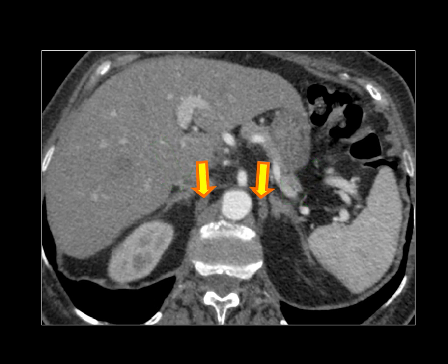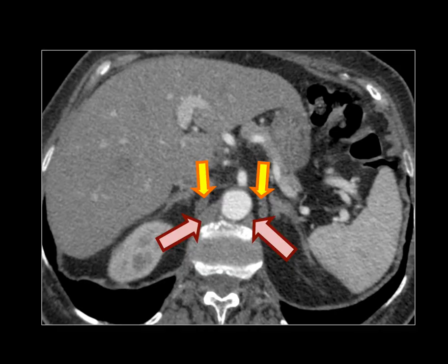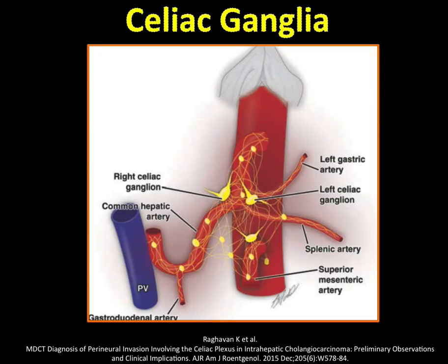Another thought is that those might represent the diaphragmatic crura, but the crura are clearly seen crossing on each side of the aorta.